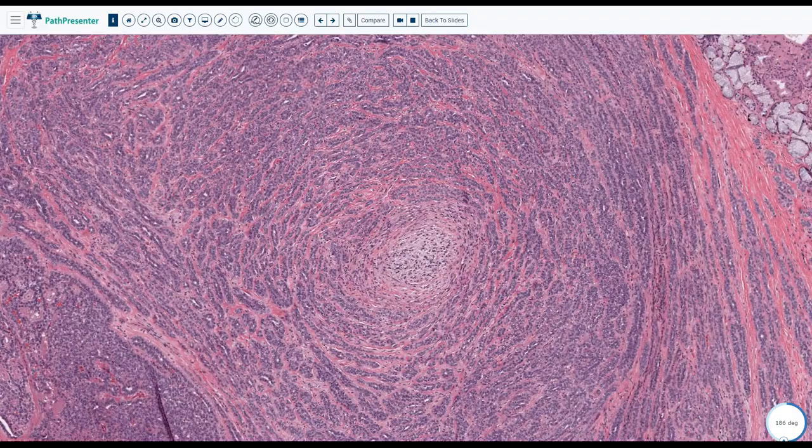Anybody know a magic word? Yeah, excellent. So some newer people say targetoid appearance. I agree. I usually like to use the fancier word. Anybody know the other fancier word for this area of growth? I see hurricane, I see an eye, I see storm. Can you make it one word together? Yes, an eye of the storm. The eye of the storm.